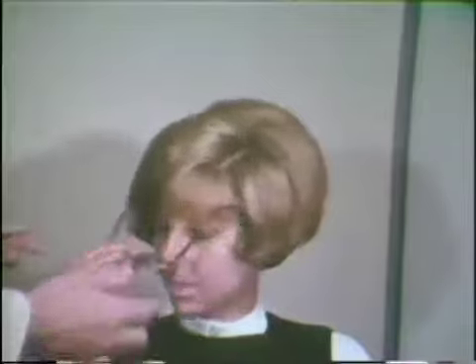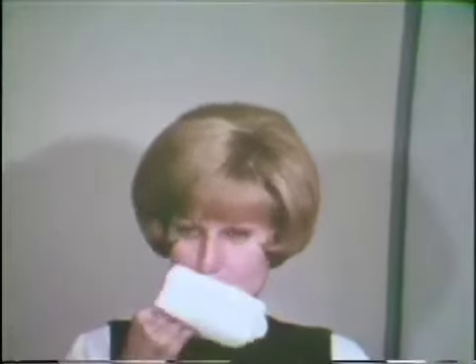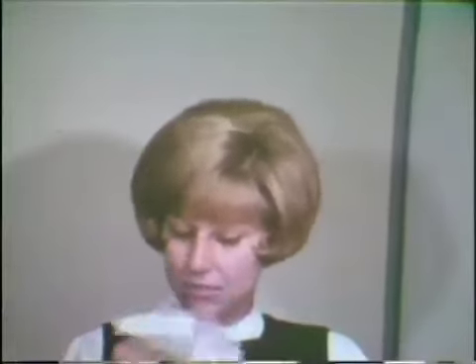The patient is seated in the chair and the headrest adjusted. As in all dental radiographic techniques, the patient is asked to remove eyeglasses, and in the case of a woman, her lipstick. Any removable dental appliances should likewise be removed at this time.